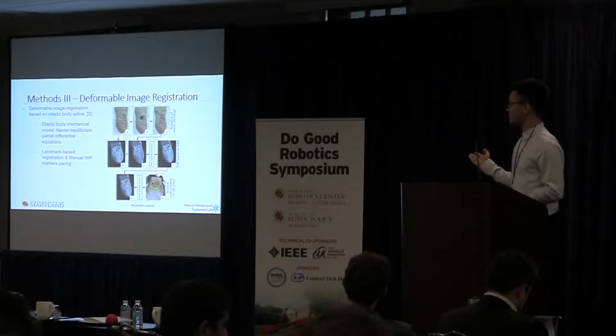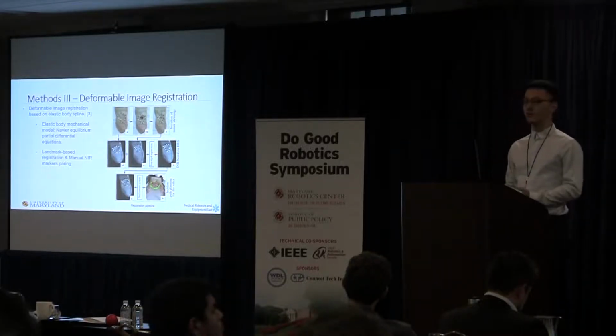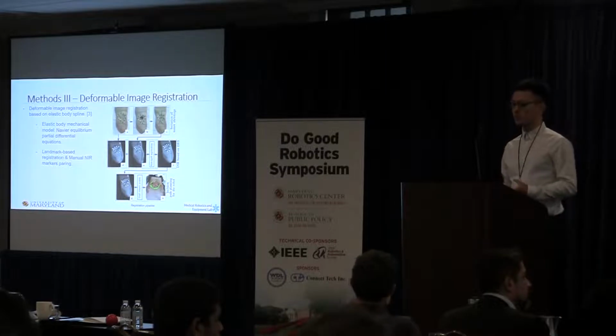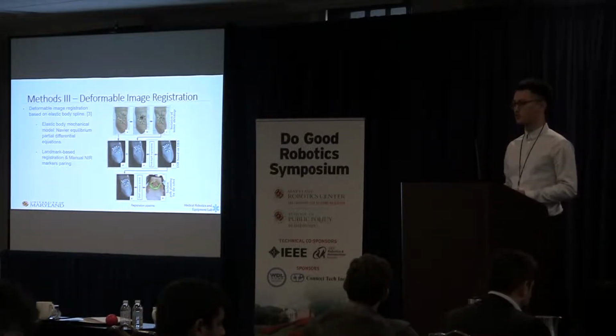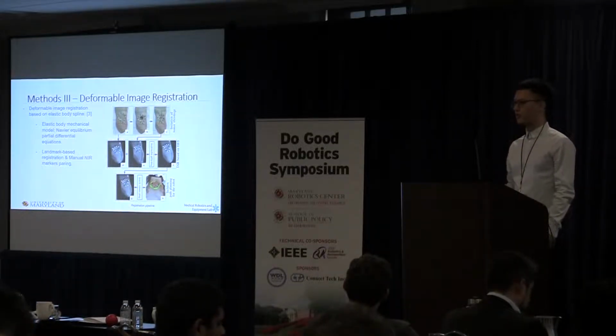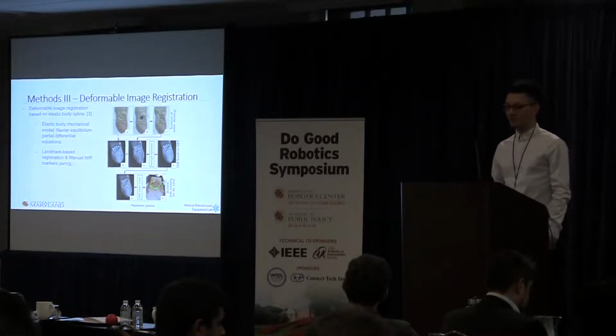I'll use the images on the right side to show how this method will work with our markers. First, prepare the samples. We got some pork tongue samples, and we drew the pseudo-tumor contours and dispensed the markers evenly on the contours. And then we cut a hole, and then closed the hole again with a purse string suture technique to imitate the tumor migration. And also we pulled the tongue tip to imitate the intraoperative tongue deformation.